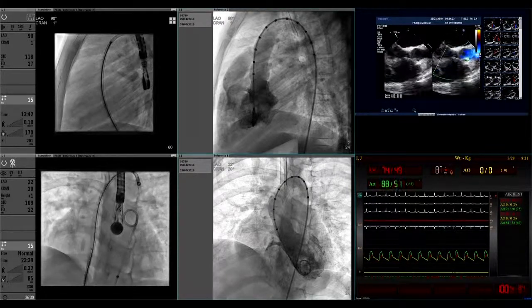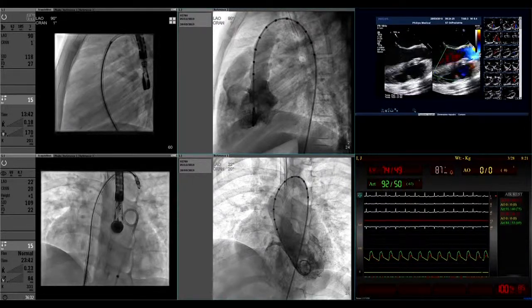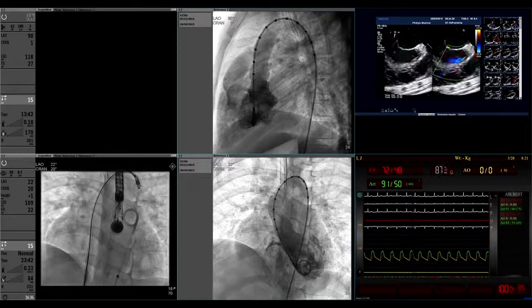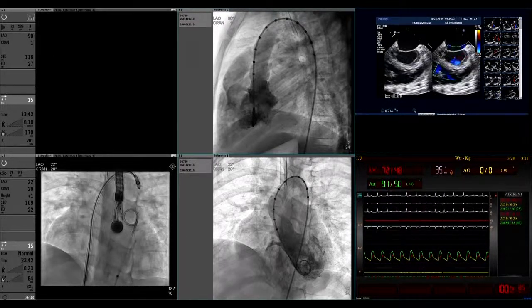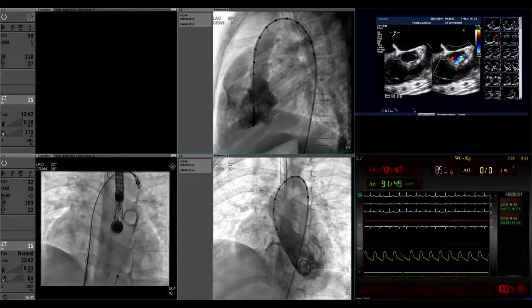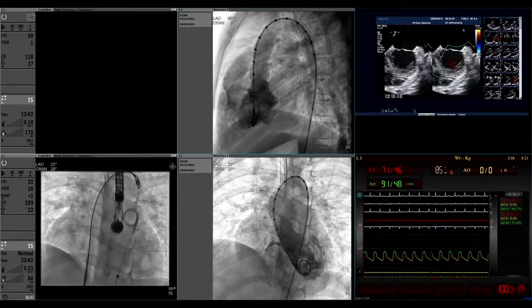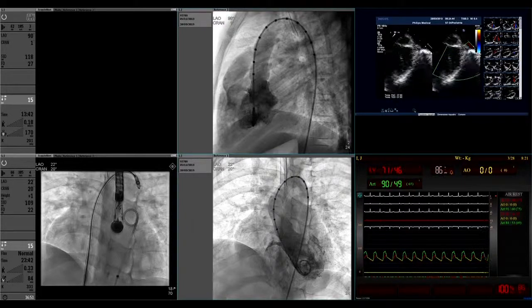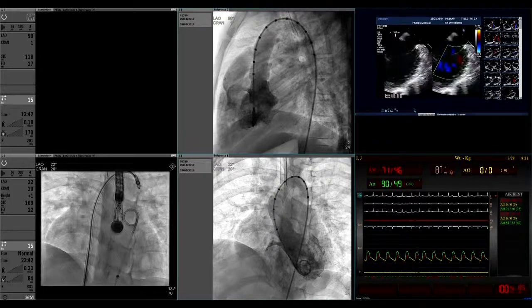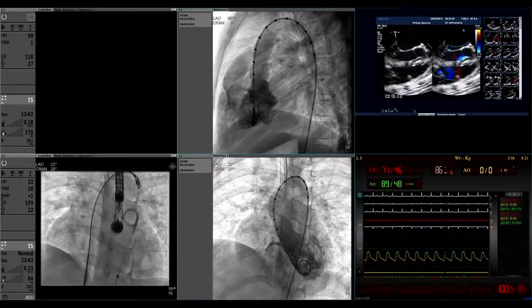In this particular case, there is a muscular portion in some view which invites maybe a double disc device because it's not so close to the aortic valve in some view. There is a muscular rim, a very small muscular rim. Yeah, I agree. It's a higher location defect.